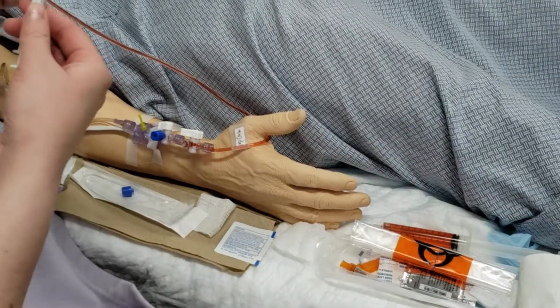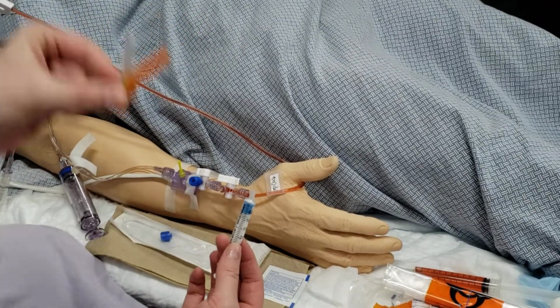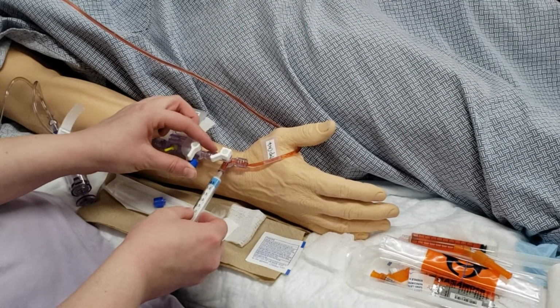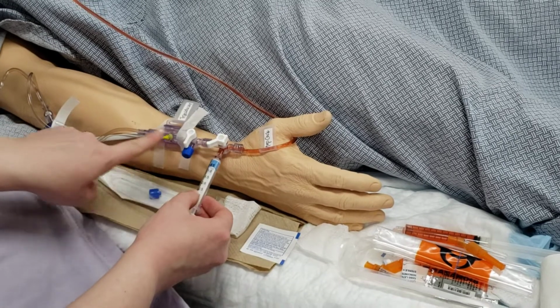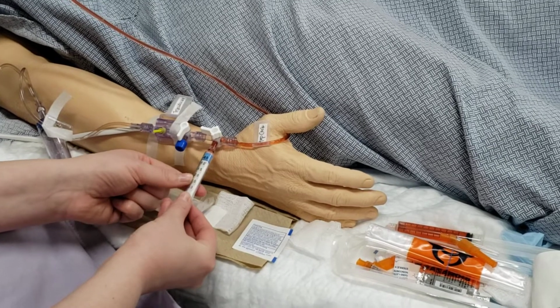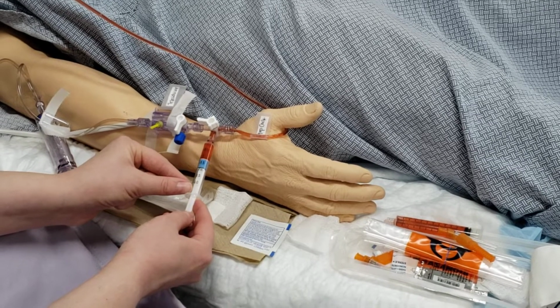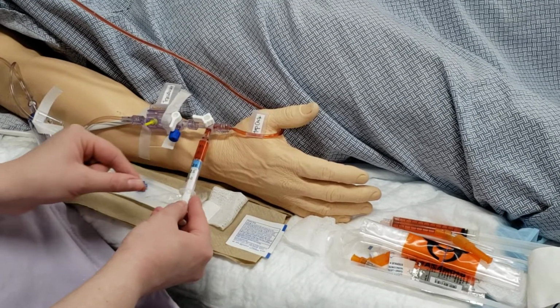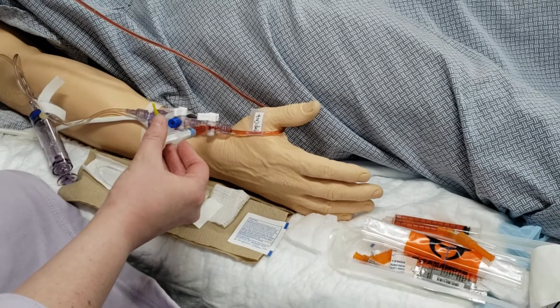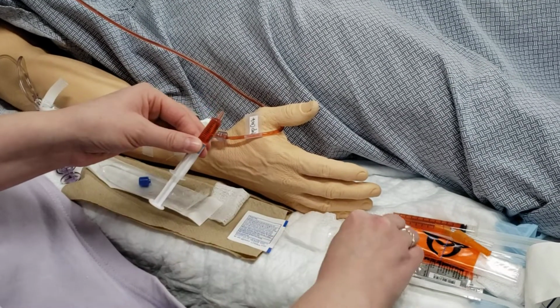Next, we take our blood gas syringe, dispose of your sharps appropriately in a sharps container, connect it onto the stopcock, again turn off to the line, pull back so that we get whole blood, however you need for your sample. Turn off 45 degrees again. Remove your sample and cap it.